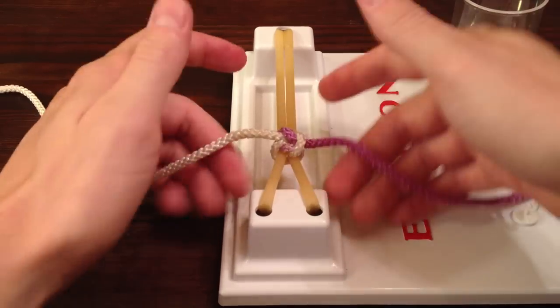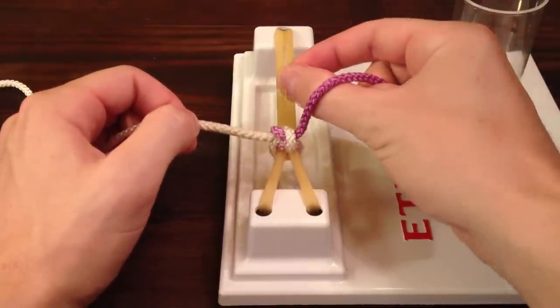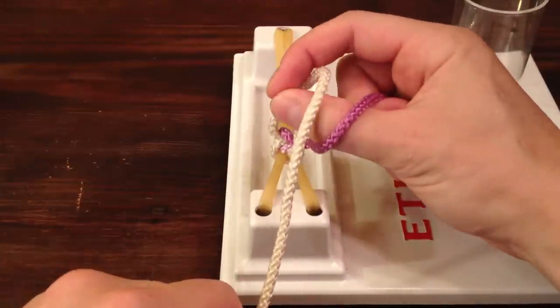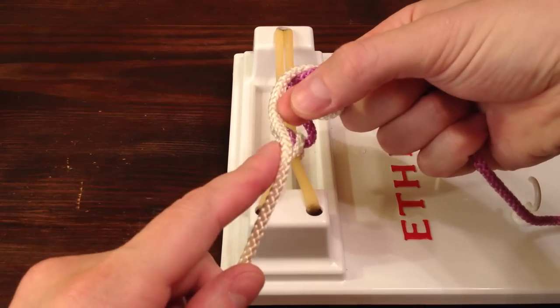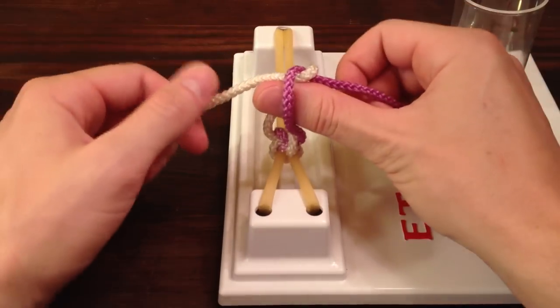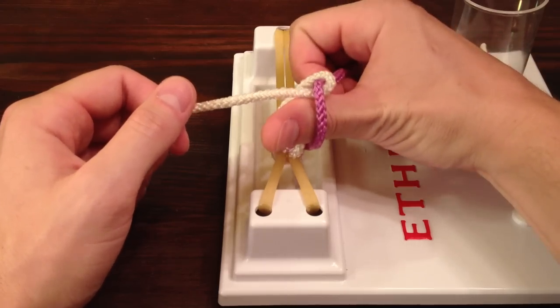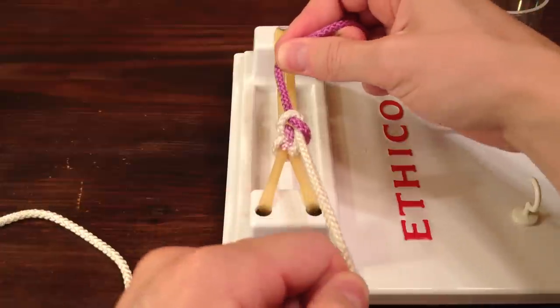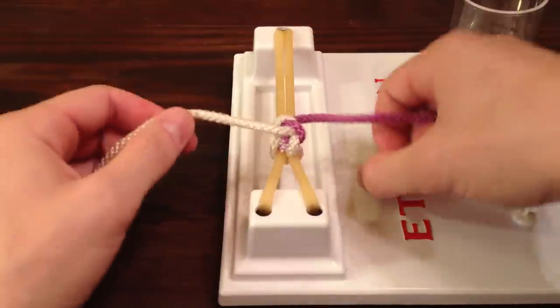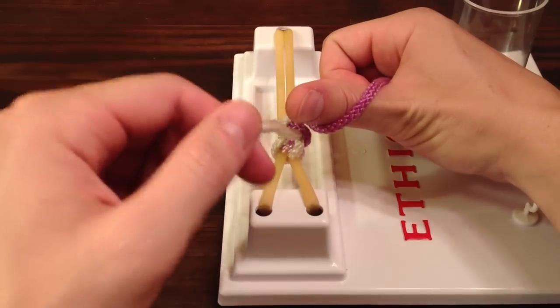So let's go ahead and do that. Grab your strings with the pistol grip, form your ring, and again we're going to start by rotating it away from us, around our thumb. Take the free end, form our loop, reform the ring, and rotate it a second time. Now we can grab the free end, rotate it a third time, and pull the free end through, giving us the overhand knot. Now this time we started the knot with our thumb, and this hand is telling me to pull the free end towards me. When I pull the free end towards me, you can see that the overhand knot sits perfectly on top of our first square knot. So when you start with your thumb, this hand holding onto the needle is your directing hand, telling the free end which way to go — come towards you.